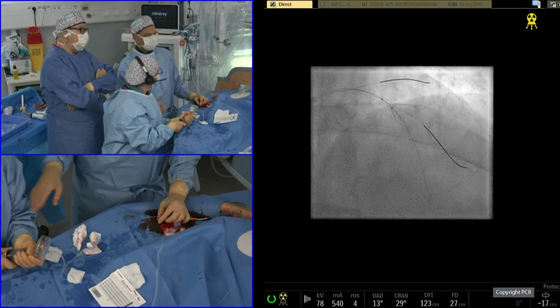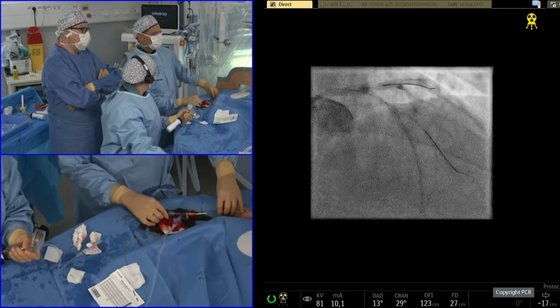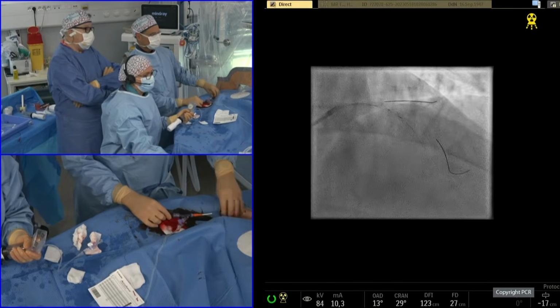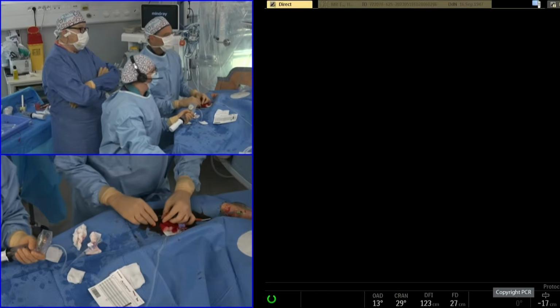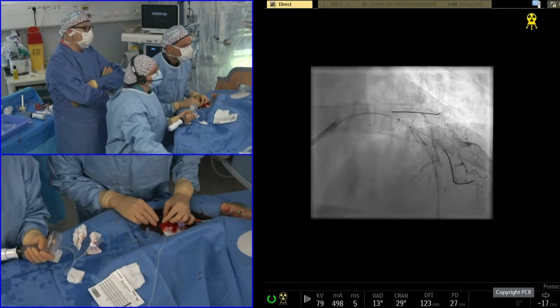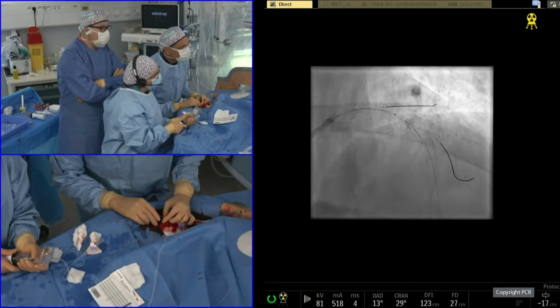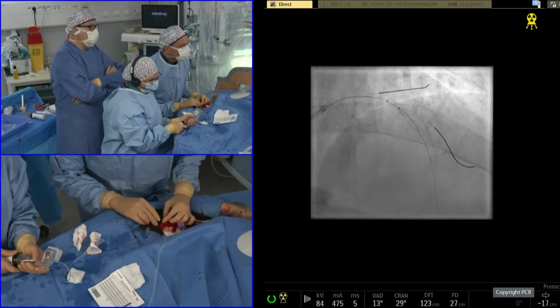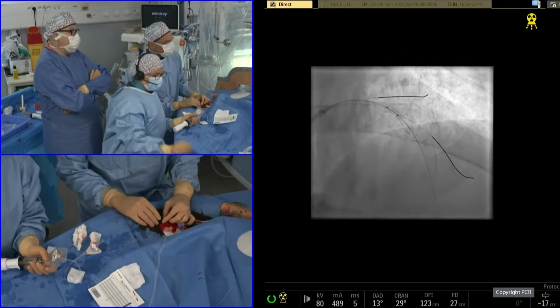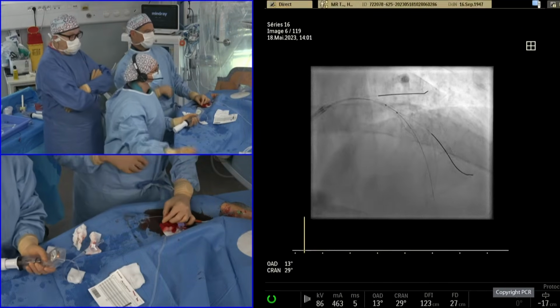We use both stent boost and injection to be sure that we are at the right position. This position there is probably too proximal, as you can see. And we need to go a little bit beyond the divergence of the wire to be sure we are in the right position.